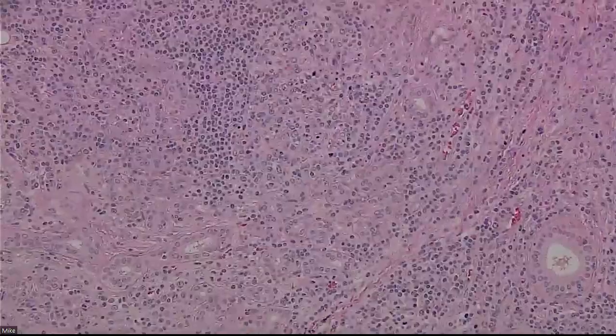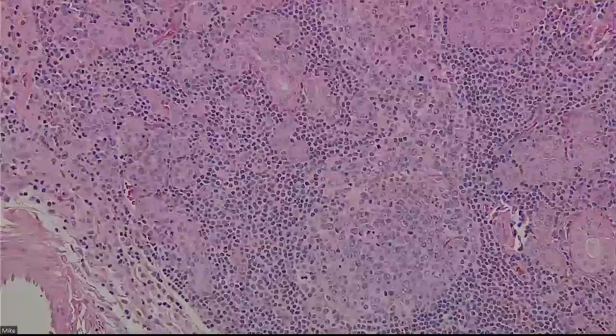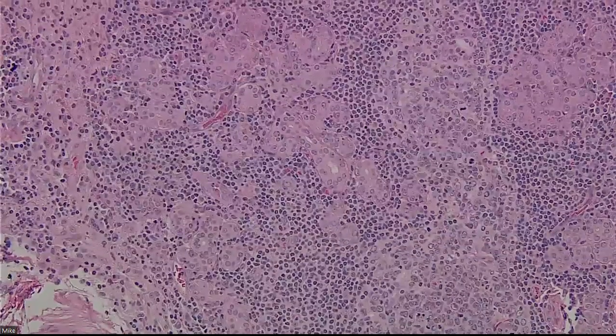There was nothing that was found in this particular case. Yeah, it's really unsatisfying, right? But sometimes you just don't know.